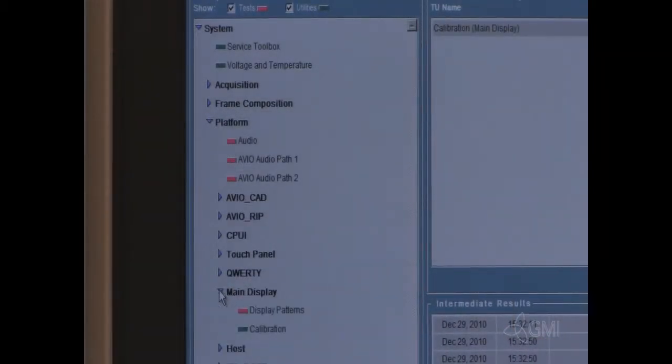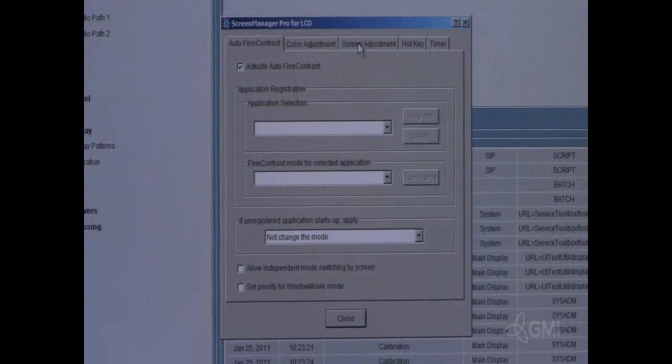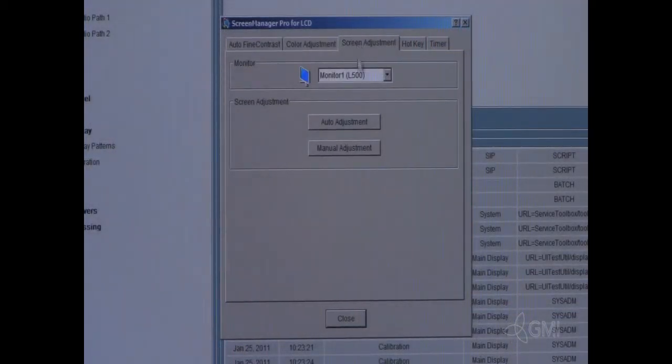Select main display, then calibration, and execute. Select screen adjustment, then select auto adjustment. The monitor will then begin to auto calibrate.